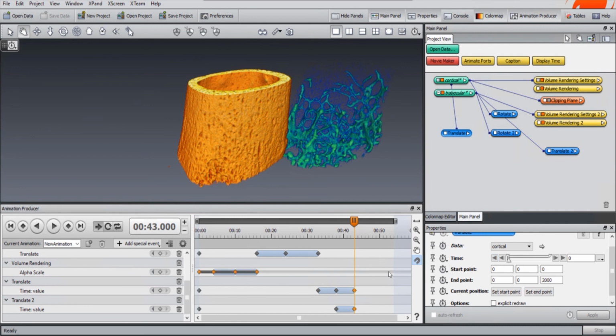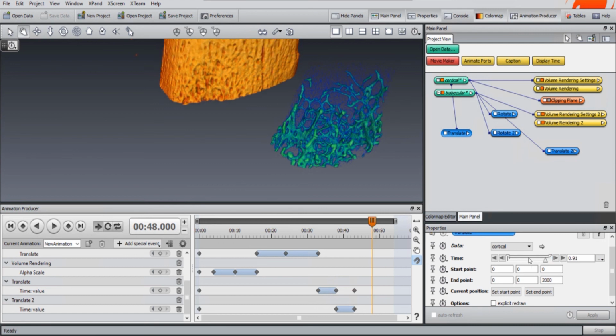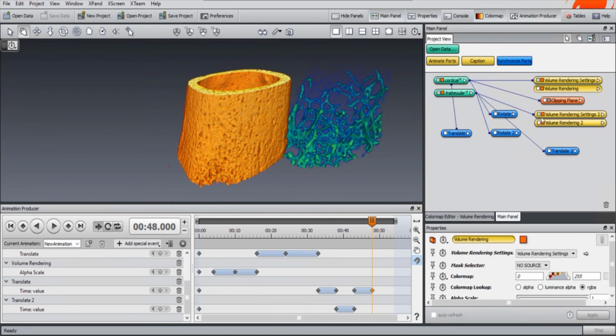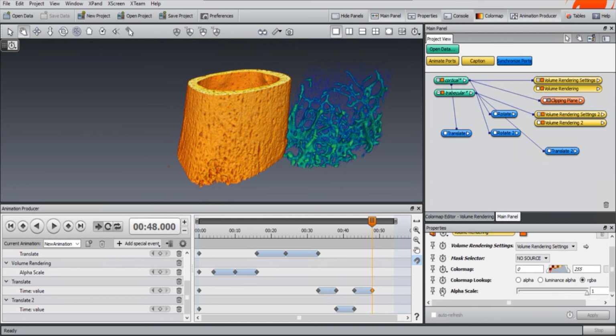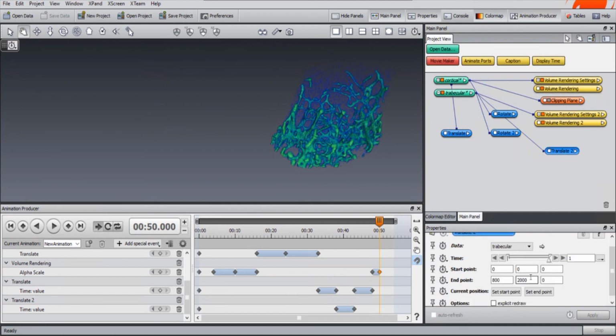and then I add, oops, I shouldn't have done this. I should have kept here and then chosen the end point. Now yes. Okay, and what I can do now is I can also make this cortical disappear from this point. Make it disappear very fast. And then now we are with this one, and we can move this one back into the same position.